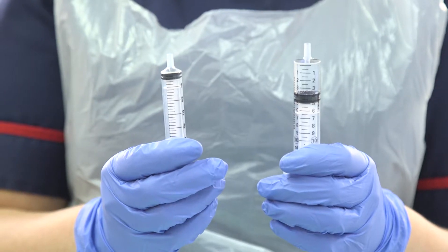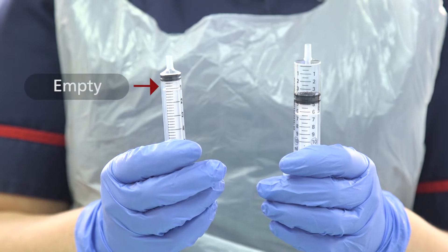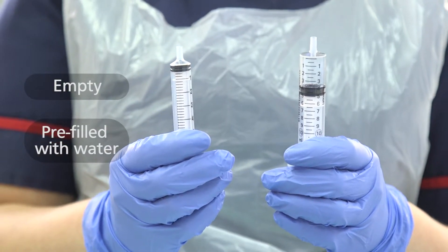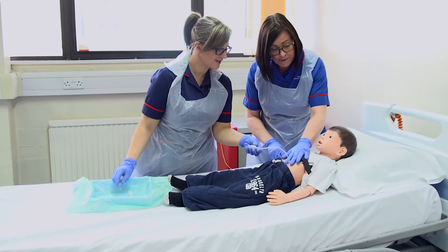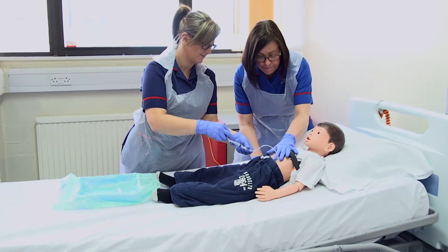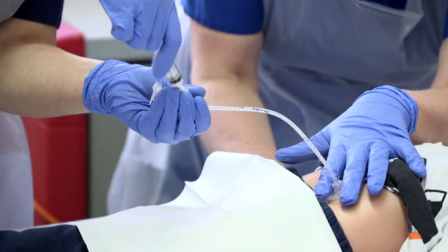Before you start you will need to make sure you have your syringes ready — one empty and one pre-filled with the correct amount of water. The nurses on the ward will discuss this with you, and it may also be printed on the tube itself. You may find it easier to do this with two people until you are confident, or you may need a hand if your child likes to wriggle.